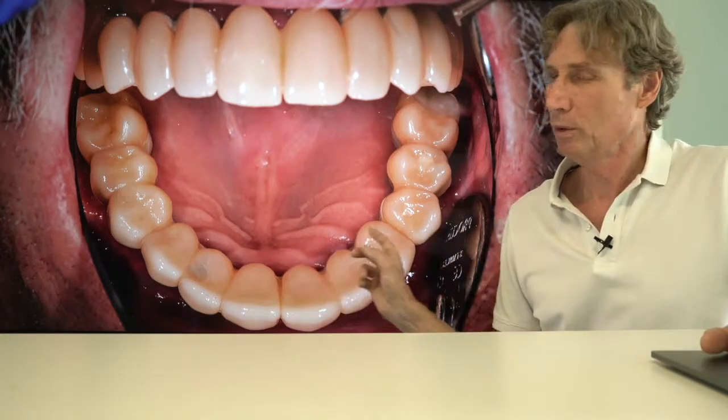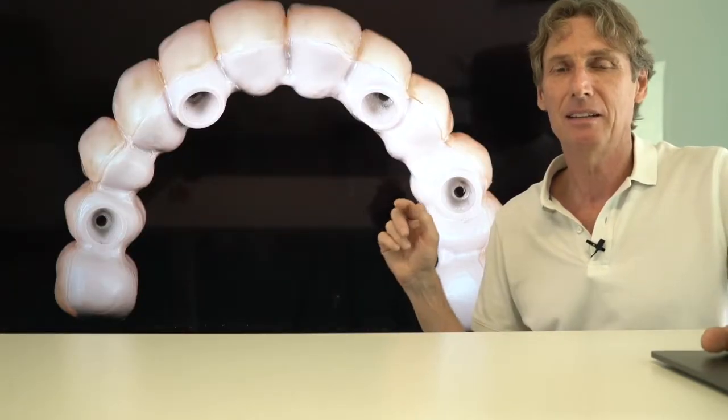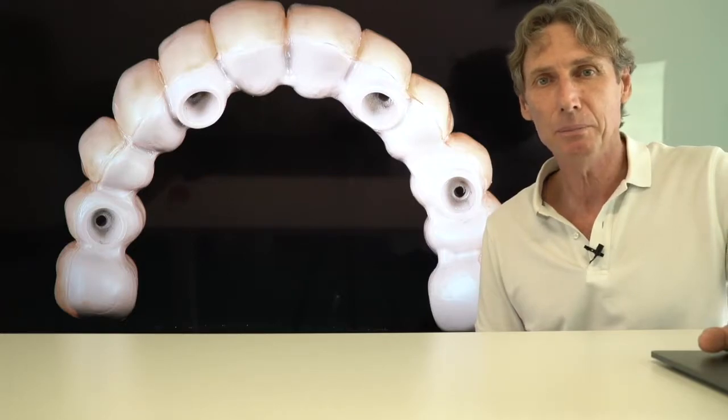We have here a patient that wears an all-on-4 type treatment in the upper jaw. We have good aesthetics with our ceramic crowns. You can see here an occlusal view. The composite closures of the screw canal are nearly invisible due to the full ceramic crowns. And I want you to pay attention that you really can only see the ceramic crowns. We have good aesthetics even if the patient is laughing with the open mouth, despite the full anatomical design of our PEEK framework.